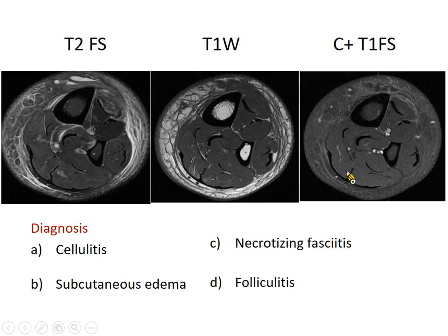So the answer is right. Necrotizing fasciitis, 85%. Get the correct answer.